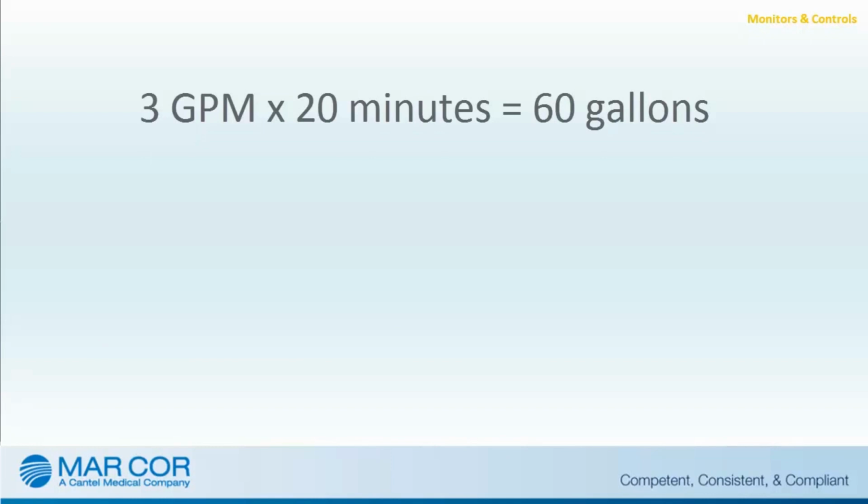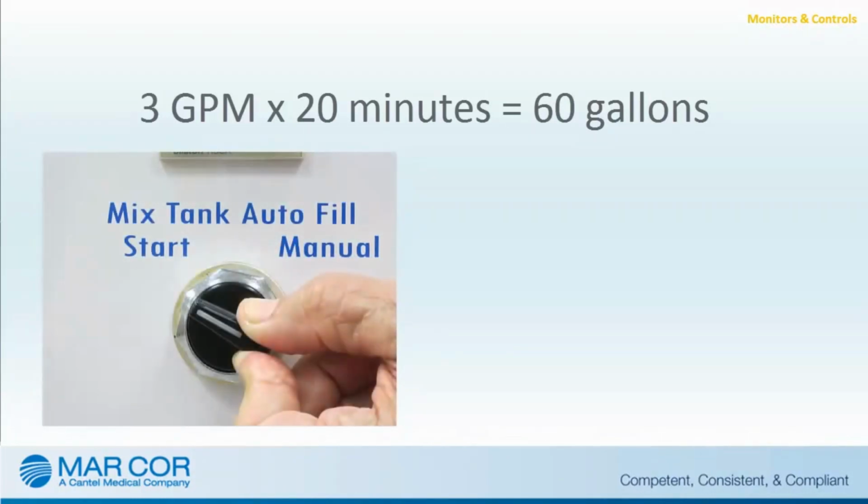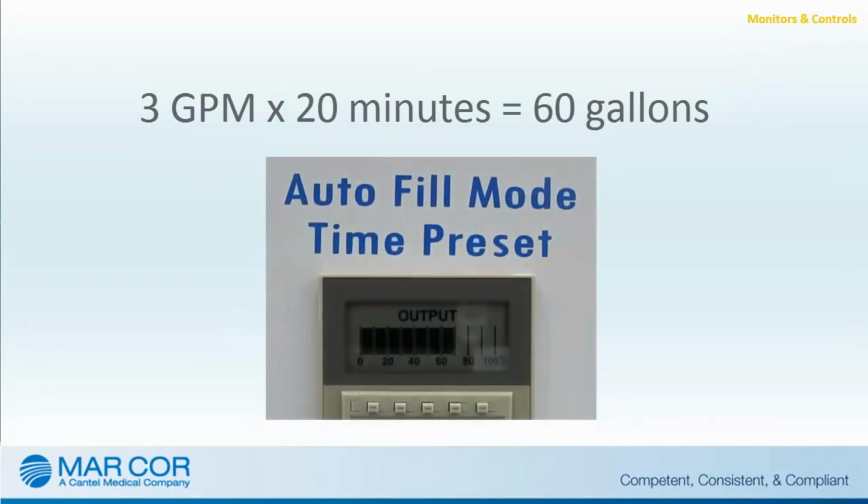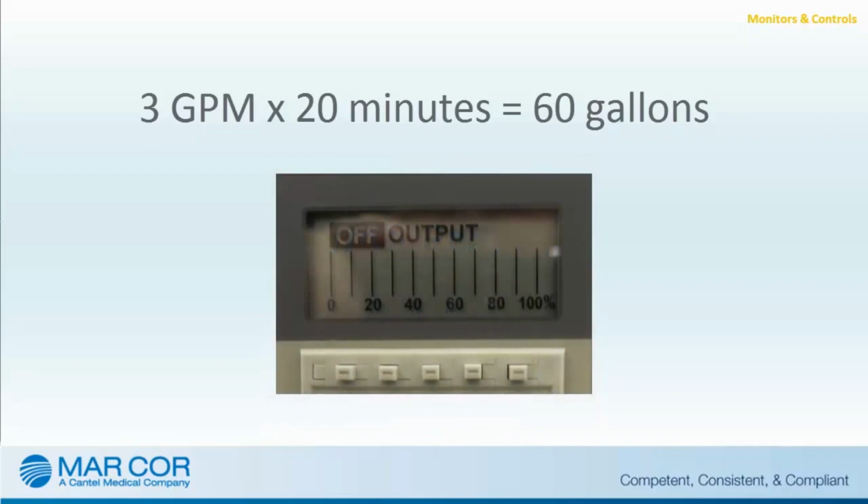Turn the mix tank autofill switch to the start position and release. The timer will blink on. Note, as the timer counts down, the display will be reduced from a full black bar to a dashed white bar, and off output will be shown when finished.